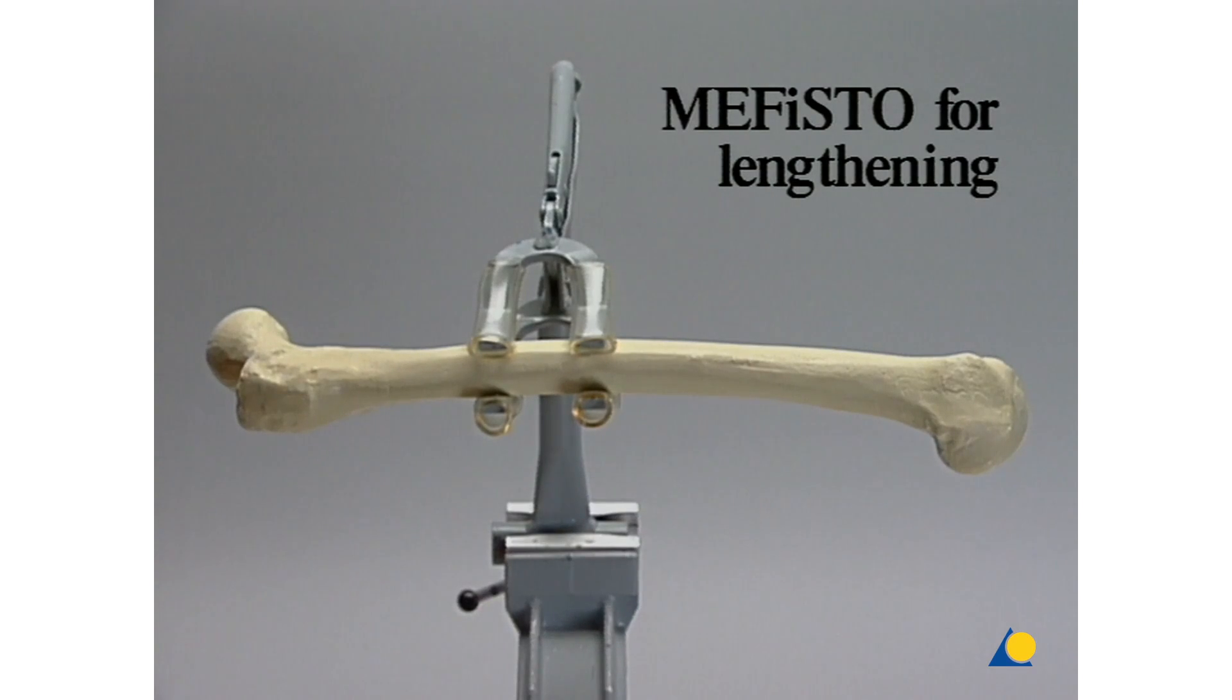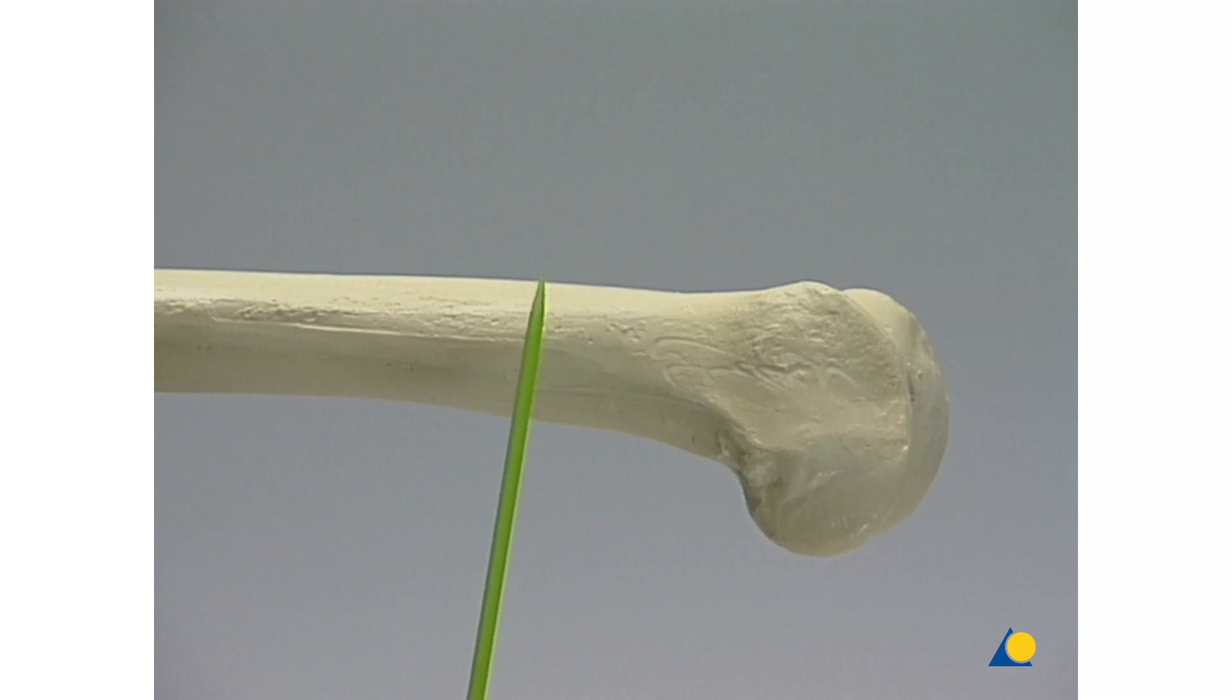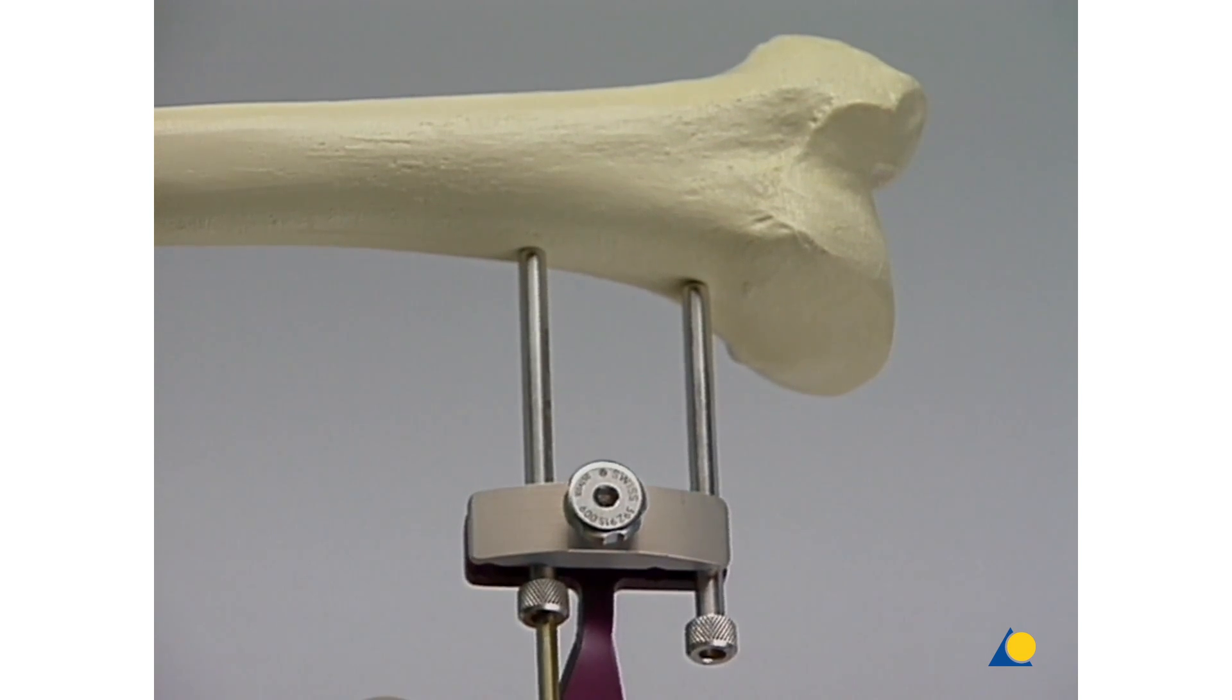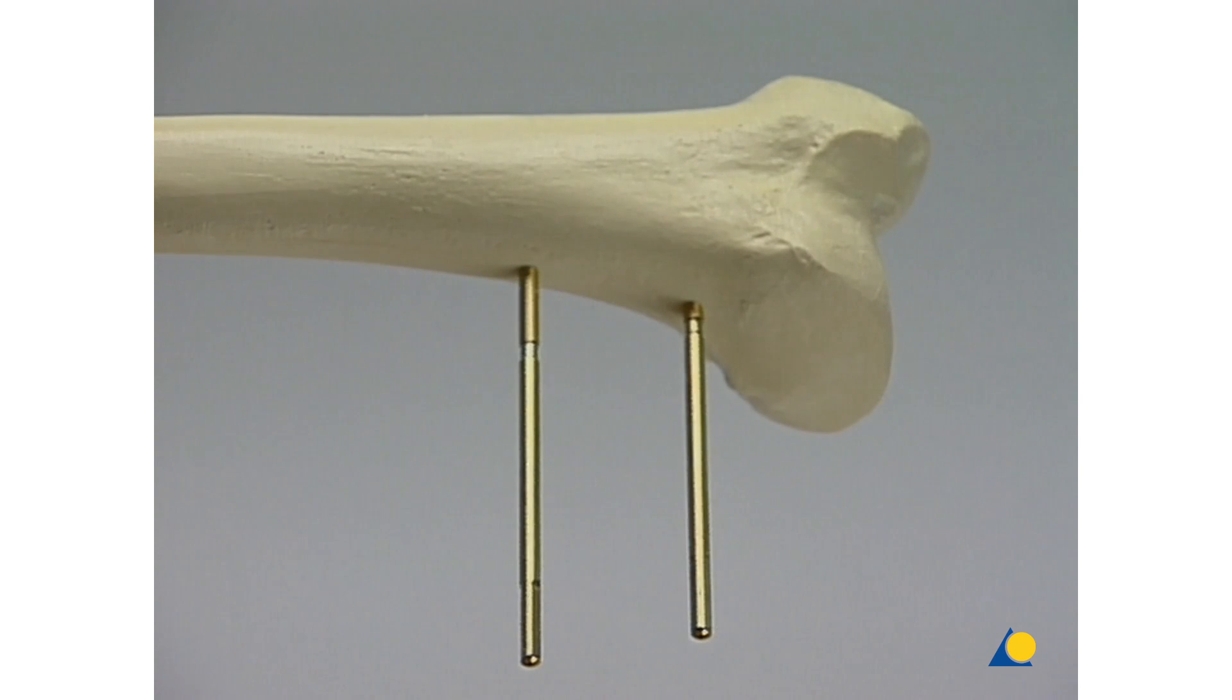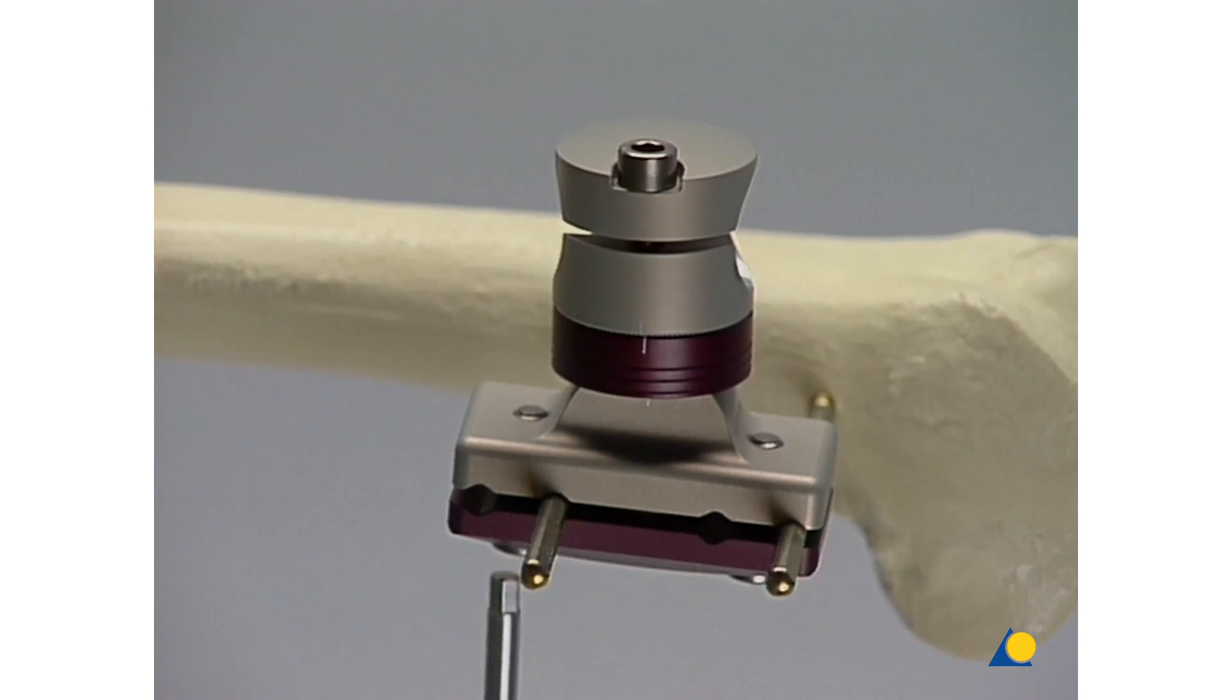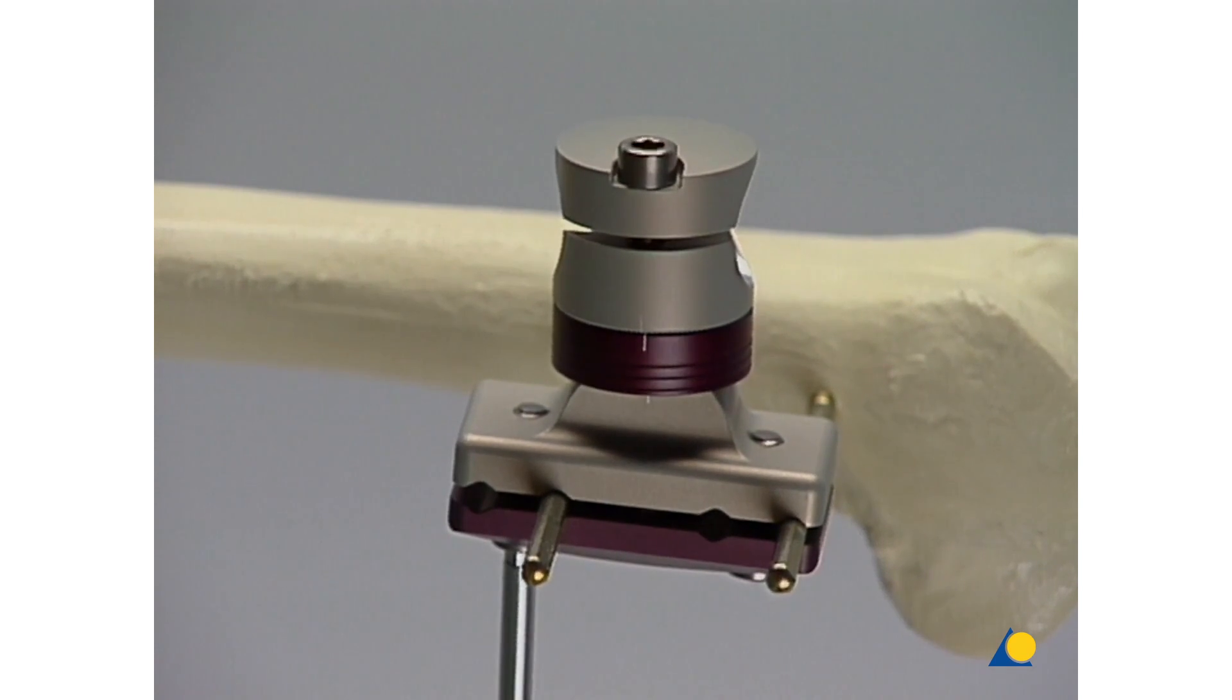Lengthening will be demonstrated on a femur with a distal corticotomy. The same principle can be used for subtrochanteric corticotomies and corticotomies in the tibia. First, two parallel Schanz screws are inserted using the parallel drill sleeve holder. Then a standard clamp is mounted on the Schanz screws.